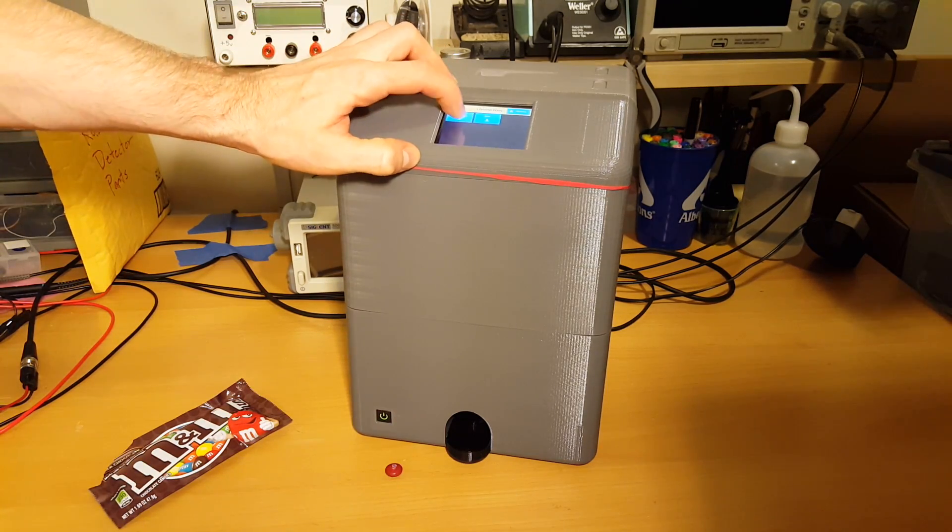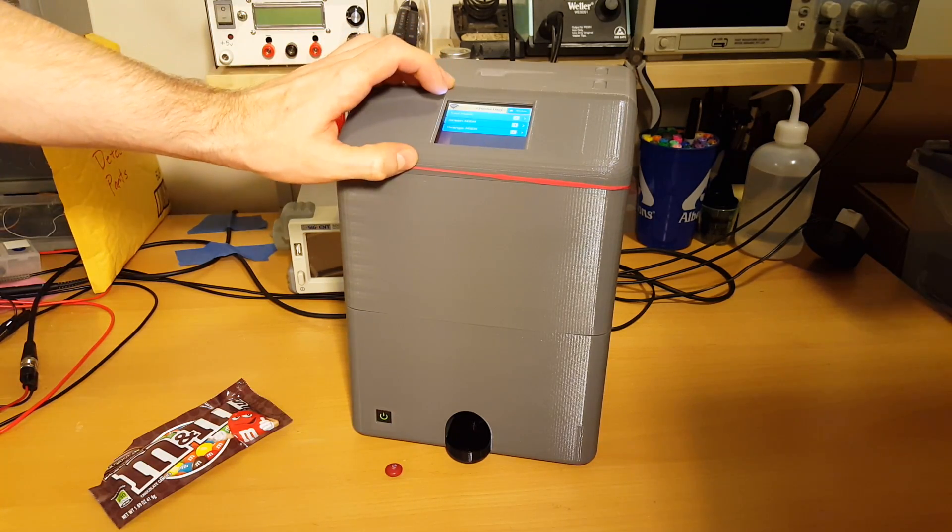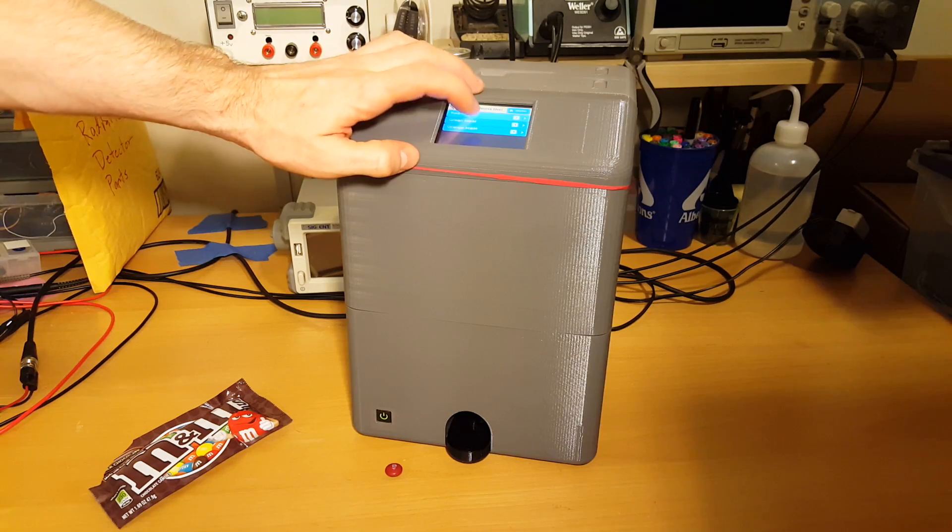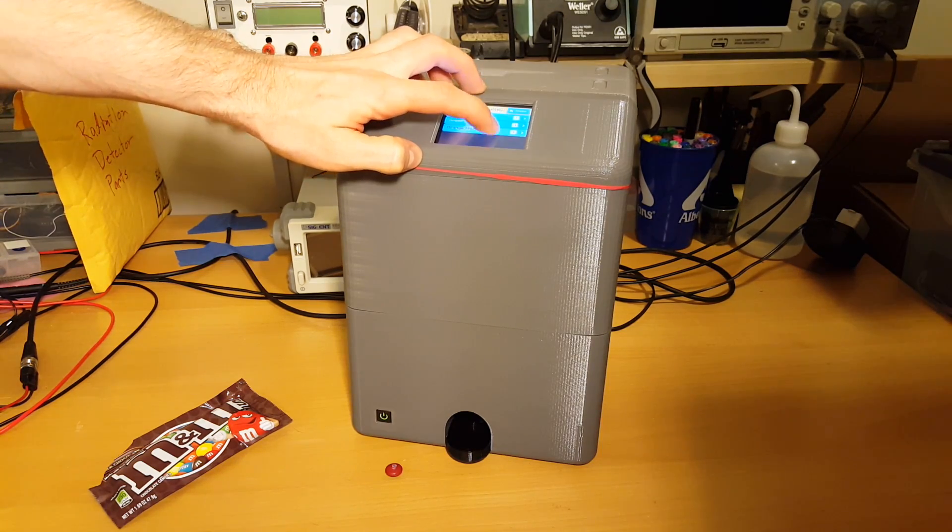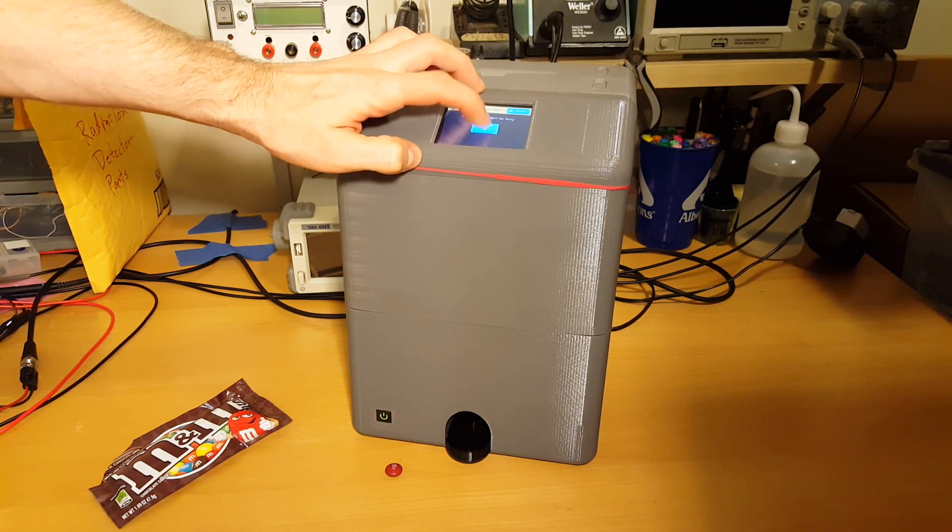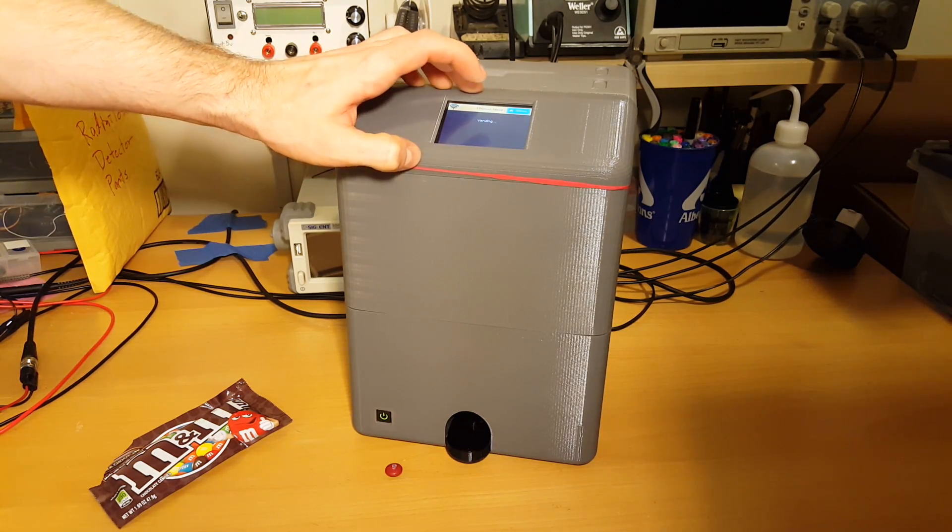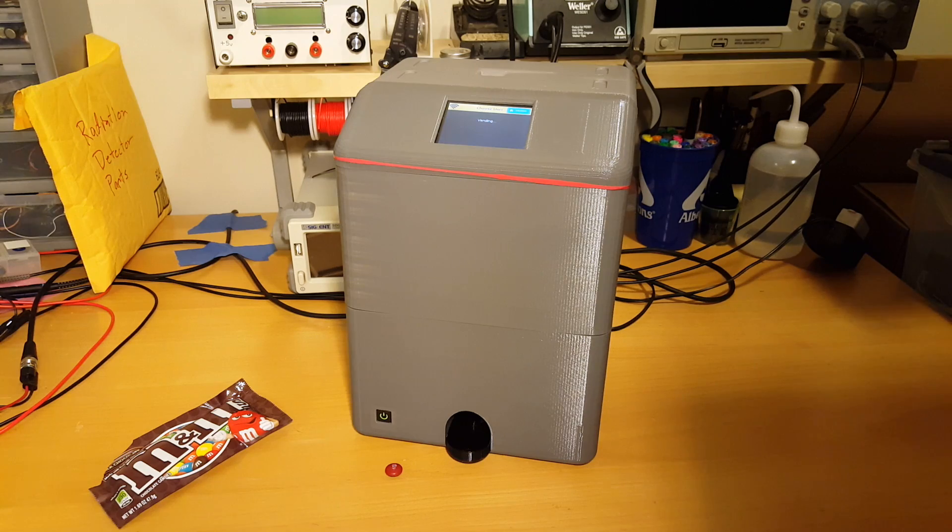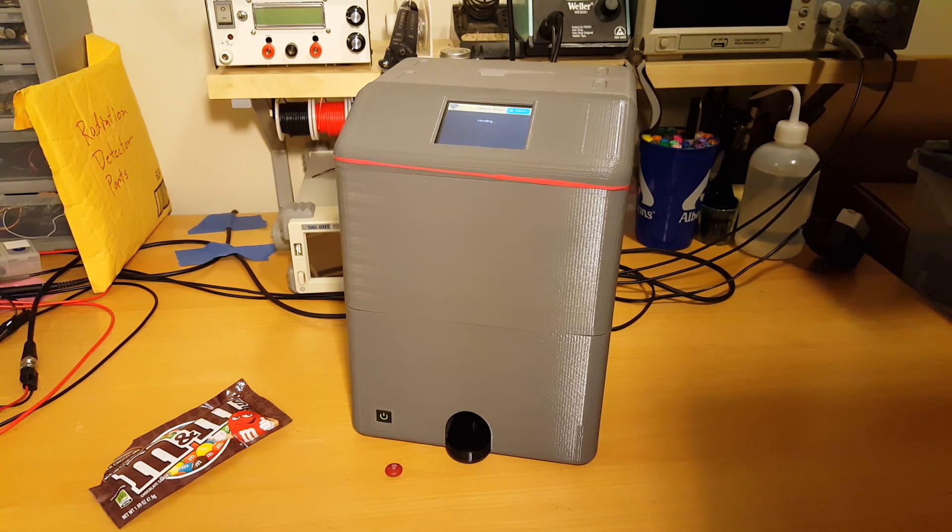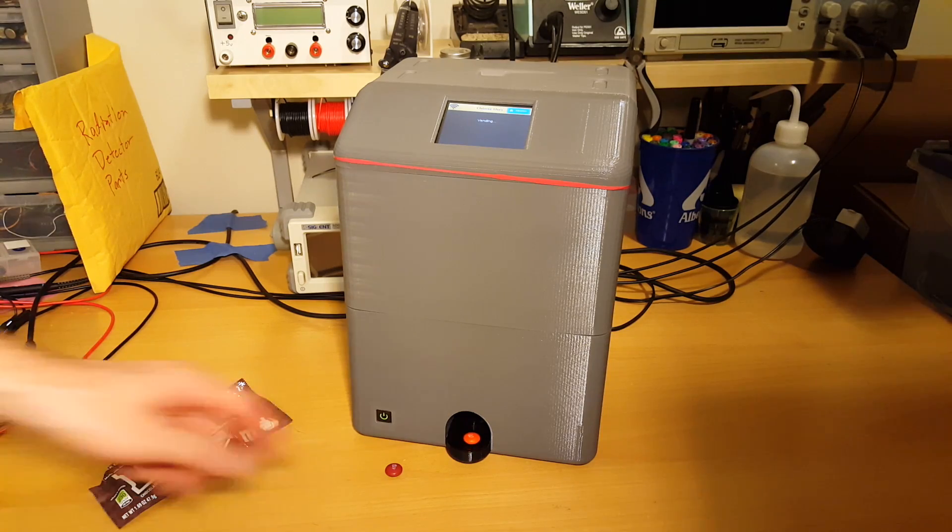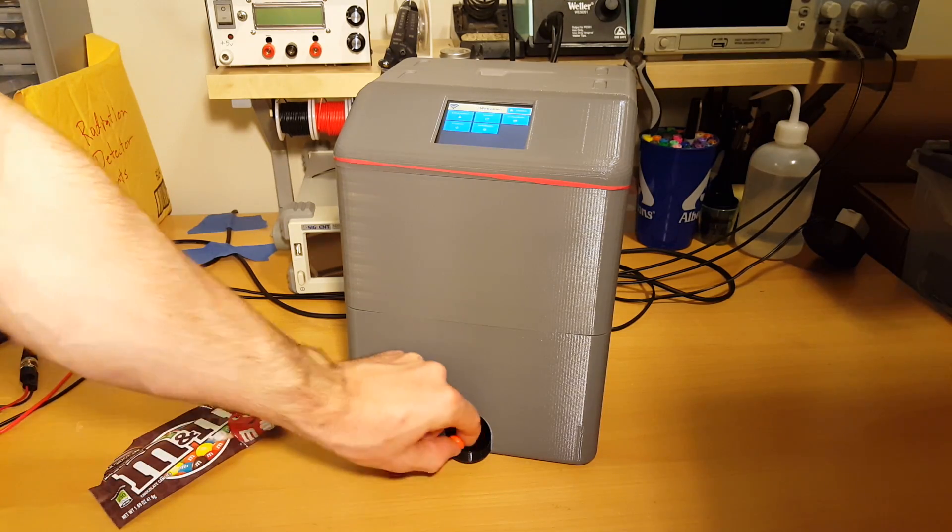Let's dispense another one. Let's do an orange M&M this time. Notice we have four orange M&Ms in the machine. There's the orange M&M.